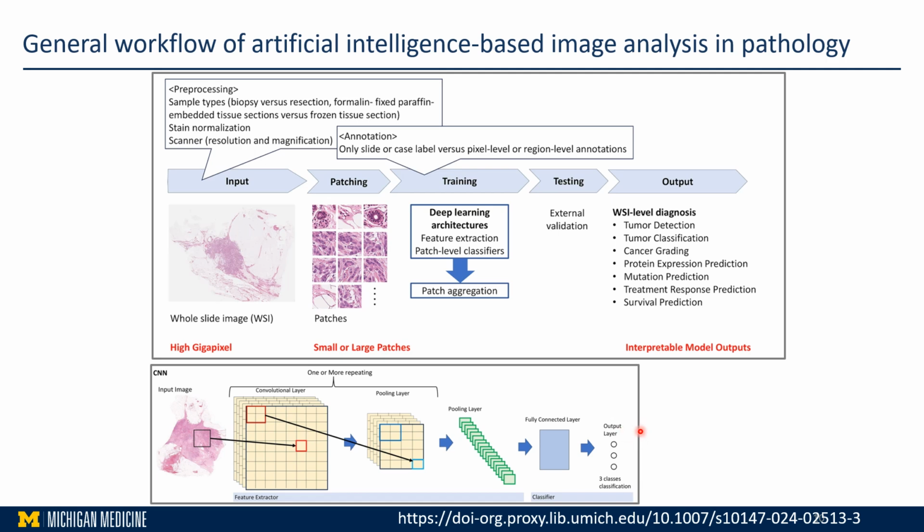Ultimately, the carefully selected features derived from the sophisticated analysis are employed to deliver accurate slide level diagnoses, bridging the gap between digital pathology and advancing AI driven insight.